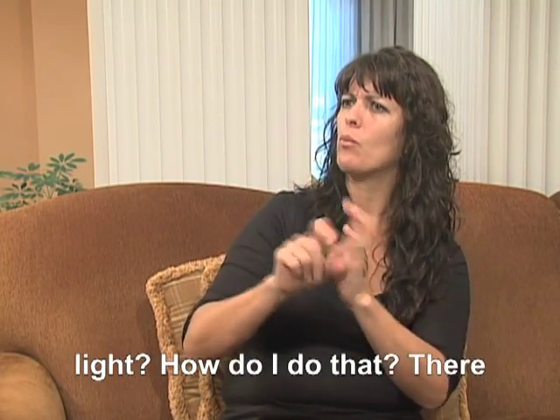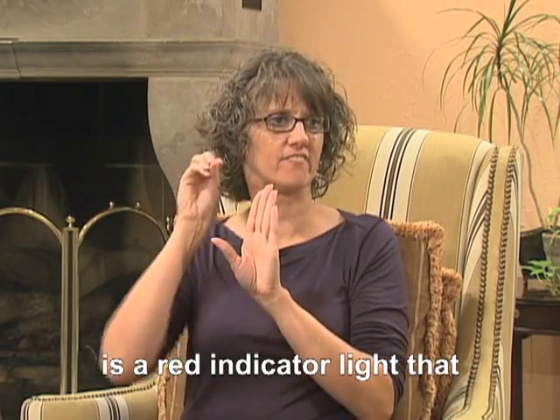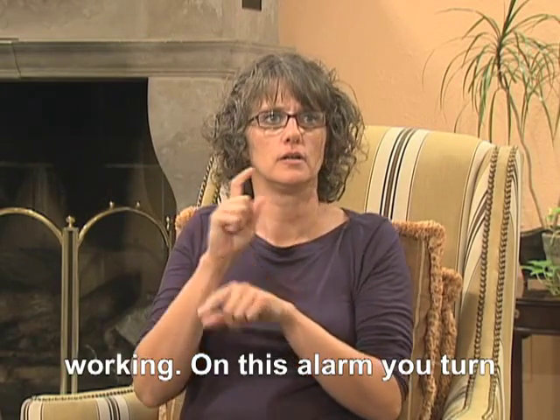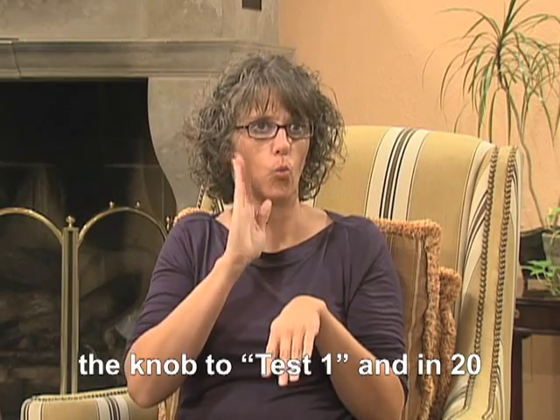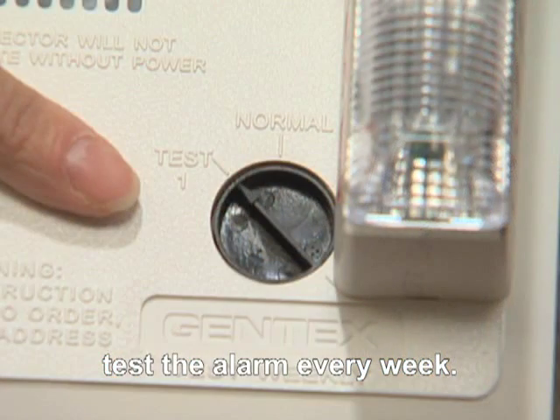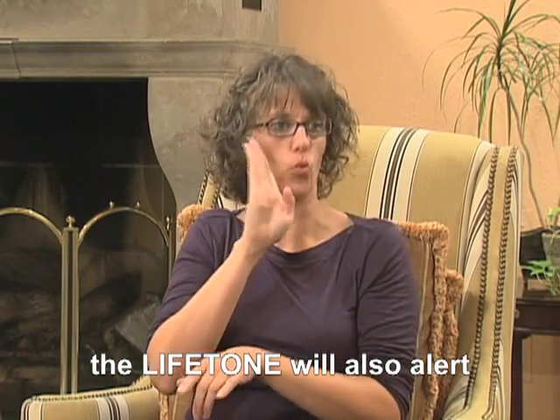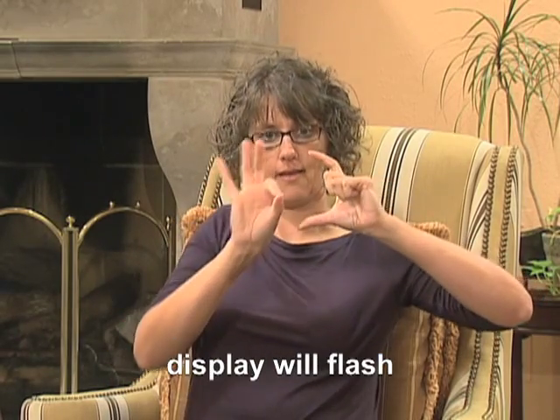How do I test the smoke alarm with the strobe light? There is a red indicator light that flashes every 30 seconds — that shows the smoke alarm is working. You can turn the knob to test, and in 20 seconds the alarm will sound and the visual signal will flash. The manufacturer recommends you test the alarm every week. When you test the Gentex alarm, the Lifetone will also alert with the bed shaker and the loud low sound. The display will flash fire.